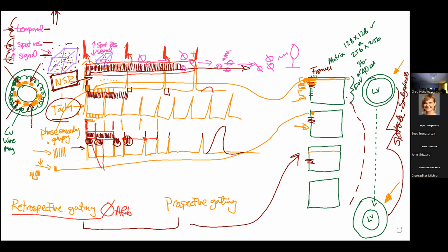Now, all of that's great, until we get to another problem. Who knows what rhythm this is? But the new problem is, and here's AFib: what if you cannot find the trigger?